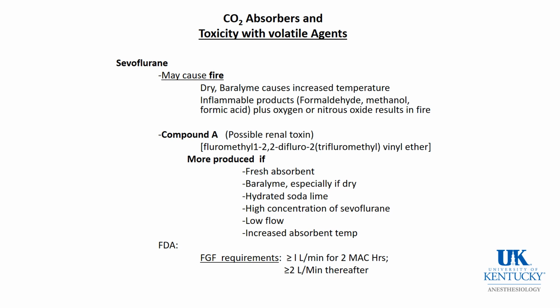It's for this reason that people avoided soda lime, because the other absorbents tend not to produce compound A. And secondly, because of this theoretic concern, the FDA says that for the first 2 MAC hours, you need to have at least 1-liter flow, and thereafter you have to have 2-liter flow, which makes sevoflurane more expensive than our other agents.